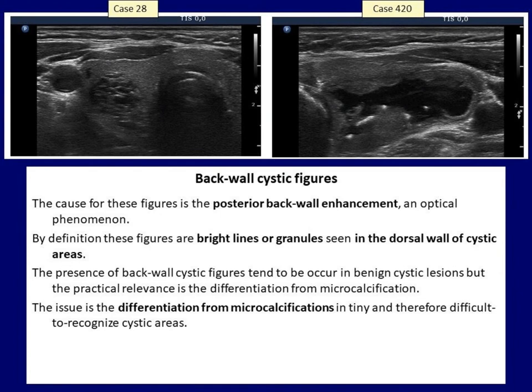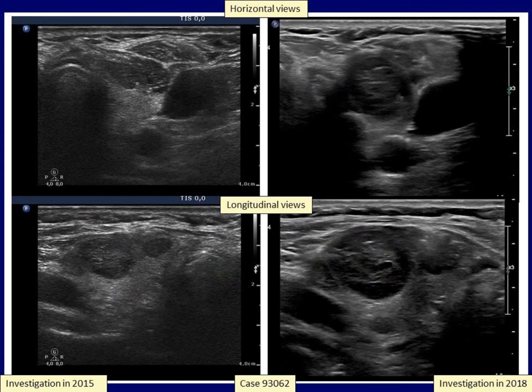These cases present back wall cystic figures of different size and shape. The common feature is that they are located dorsal to cystic areas, which may be very tiny as in the figure marked with the yellow arrow. Occasionally, the origin of a hyperechogenic figure cannot be clearly determined — the figure marked with yellow arrow might be a comet tail artifact or a back wall cystic figure. In the left images, we can see punctate echogenic foci which are not clearly within cystic fluid; the nodule also has back wall cystic figures in the form of lines visible in the longitudinal scan.